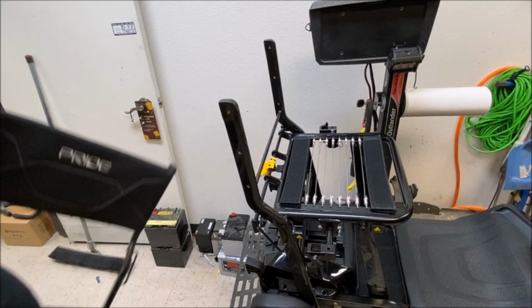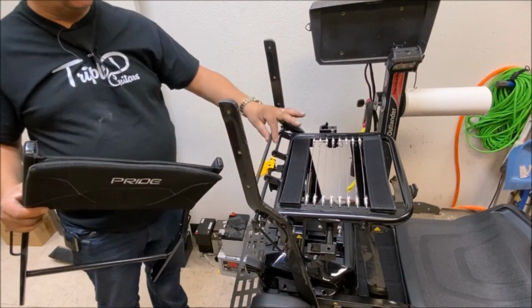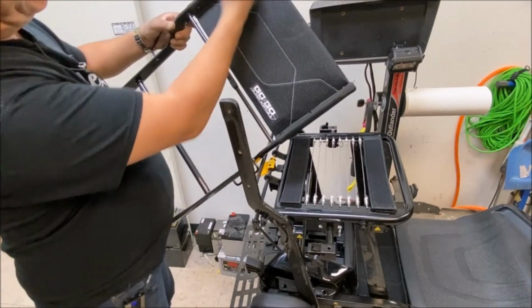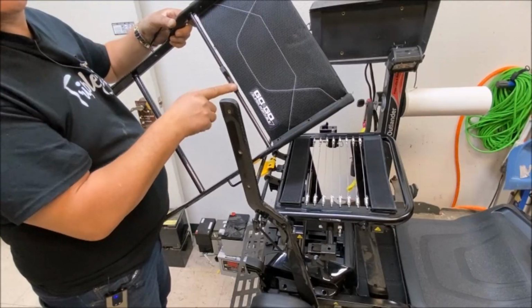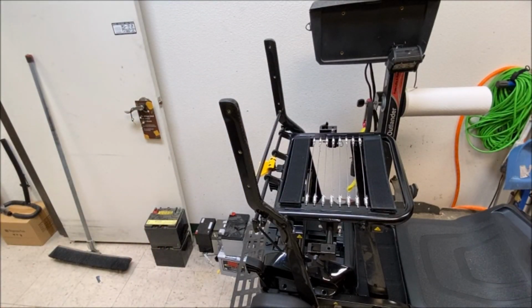Alright, so basically what I've done, I removed the 6 screws from there and there, plus the 2 screws that hold this on, 6 screws and the 2 screws that hold that on, and transferred it to the new piece. I can put that to one side again now.